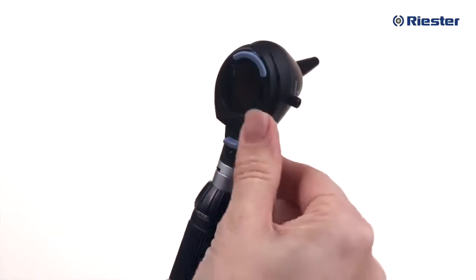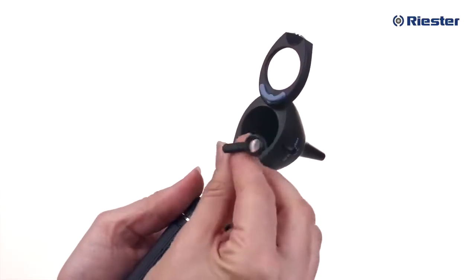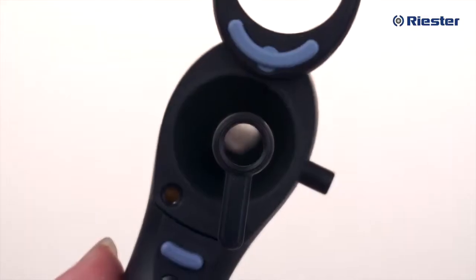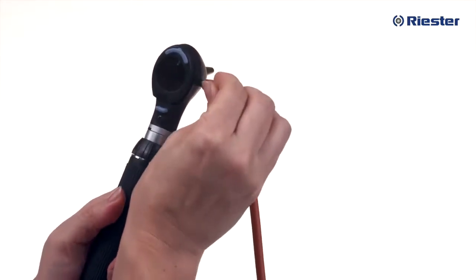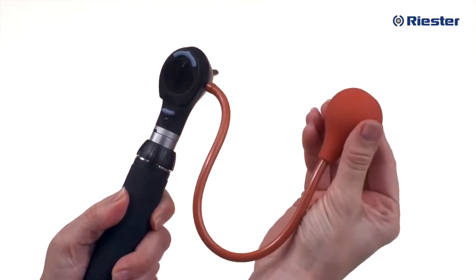Other features of your Riester RiScope otoscope include the swiveling lens, which allows insertion of instruments, an additional operation lens with fourfold magnification, and a built-in connector on the side of the otoscope head to attach the insufflator bulb for pneumatic otoscopy. The insufflator bulb is sold separately.